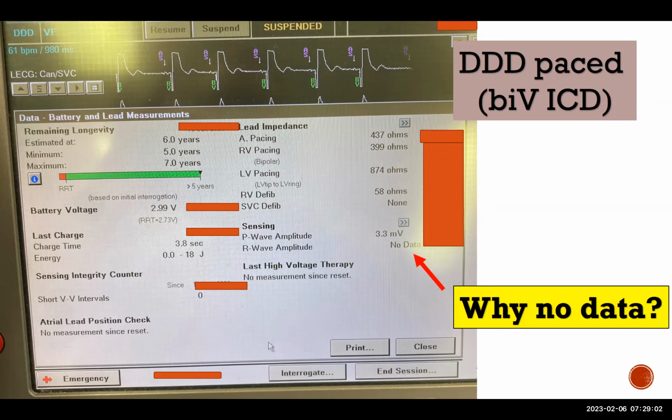And so when we do that, some of you have noticed that when we do pacemaker checks in the office, I'll often ask the patient to lie down, right? One of the reasons is that it's easier to see the electrograms, and the device attached outside of the body, the mouse, is not moving when it's doing the recording and connection to the programmer. But the other reason is that when I do a sensing test, I have to lower the patient's heart rate pretty low, and sometimes as low as 30 beats per minute. And I don't want patients fainting during that part of the test. So we have them lie down, and then we lower it down.